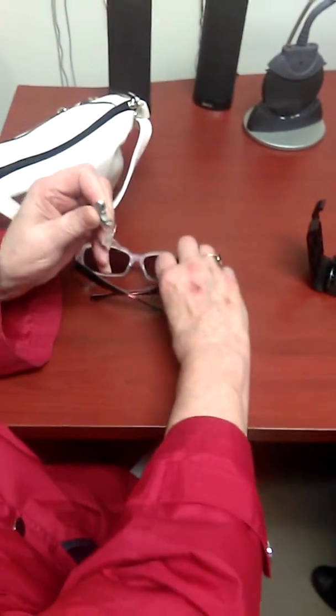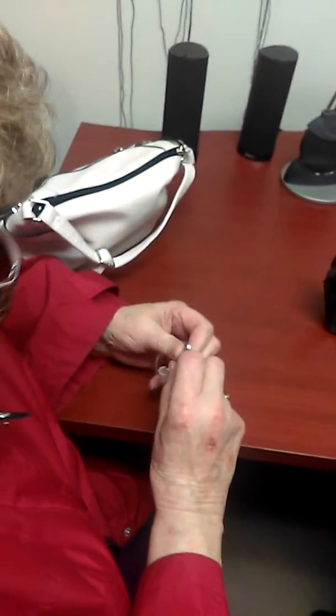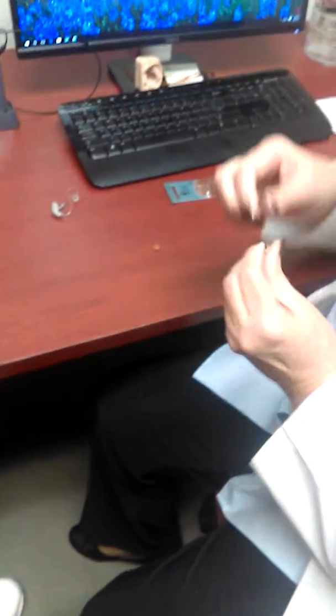I don't have my other glasses here. Can you see with the dark glasses on? Can you see that? Yeah. Okay, now here's what we're going to do. I'm going to take the battery. Now you know you have to take the tab off, right? You can wait a while too — about three to five minutes. All right, then this battery.